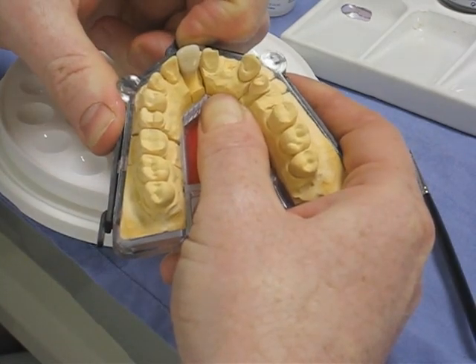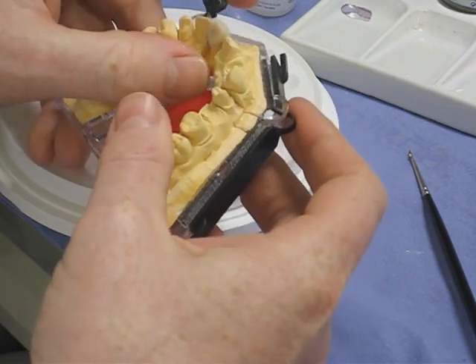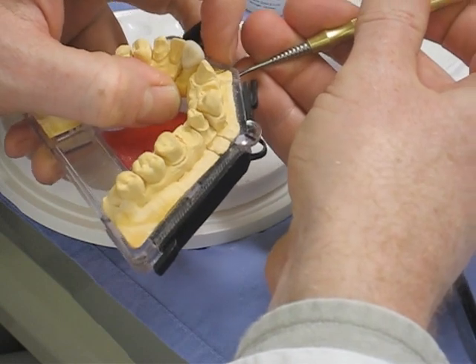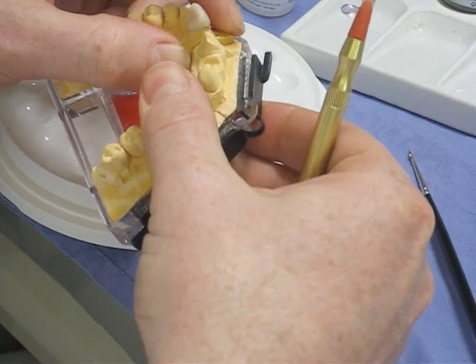Then take the die with the crown out of the model, and I'll just probably put some stain on interproximately as well, just to darken it down there, just down in the margin region.